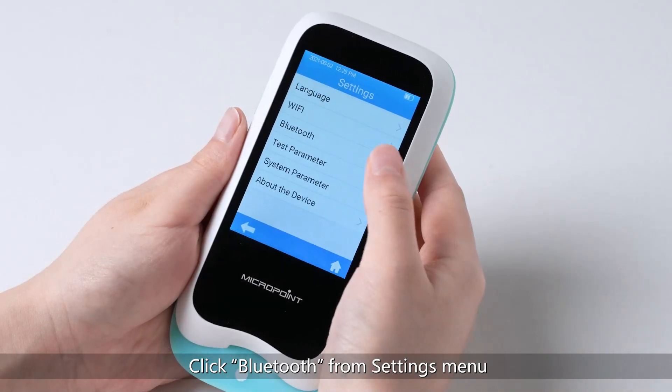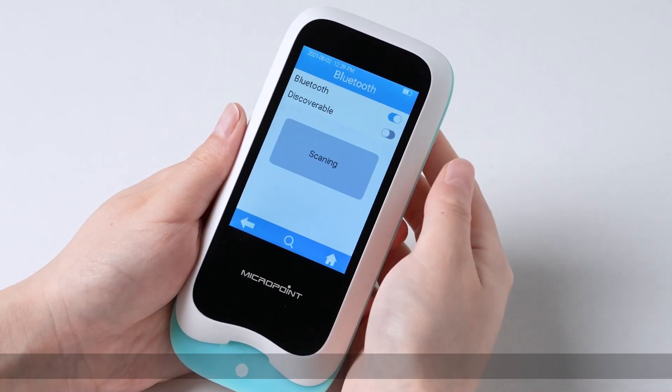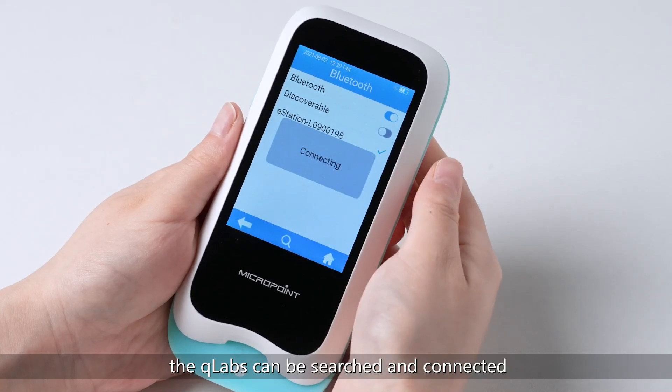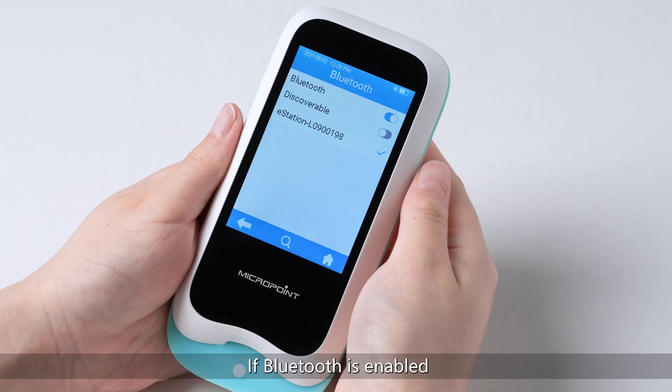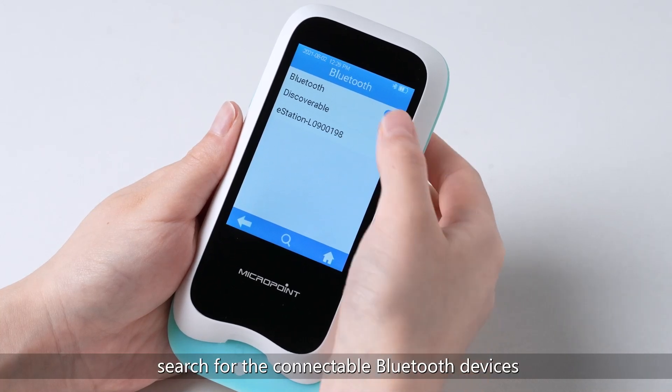Click Bluetooth from the Settings menu. Click the Bluetooth button to turn on or off. When both the Bluetooth and Discoverable buttons are turned on, the Q-Labs can be searched and connected by other Bluetooth devices. If Bluetooth is enabled and Discoverable is off, click one device from the list. When the Q-Labs shows Check, connection is completed. Click the Search button to manually search for connectable Bluetooth devices.